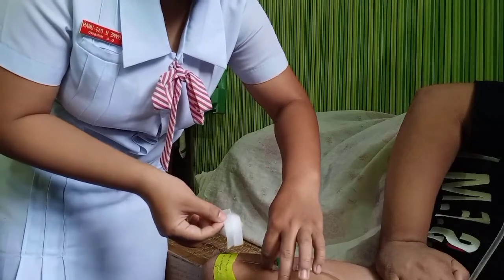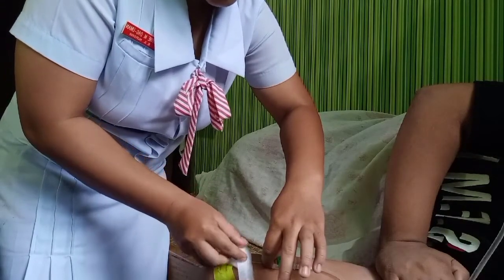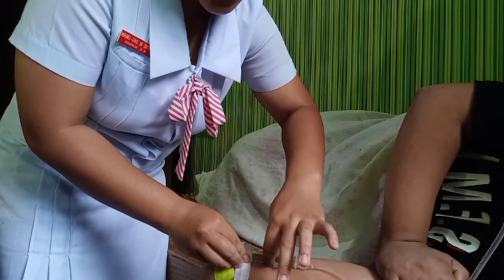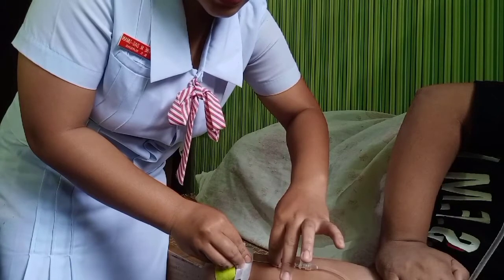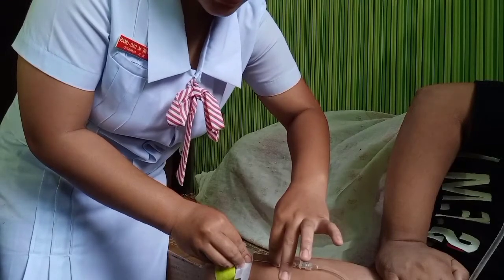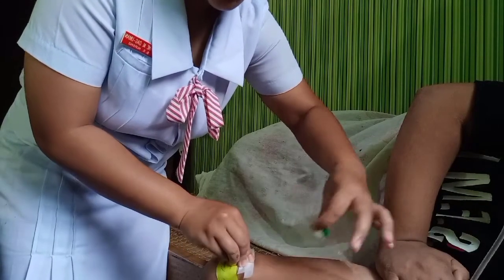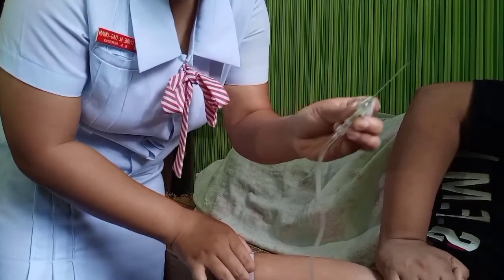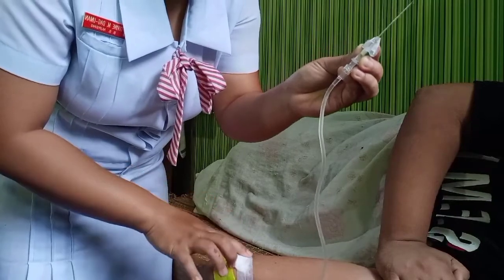So to avoid that, we are going to put the dry cotton with a plaster onto the site of injection, and then detach the cannula from the injection port slowly. A second after detaching the cannula, we apply a gentle pressure to the cotton balls on the site of injection. If the patient is able to do so, let them.